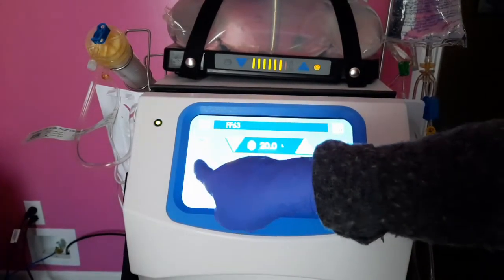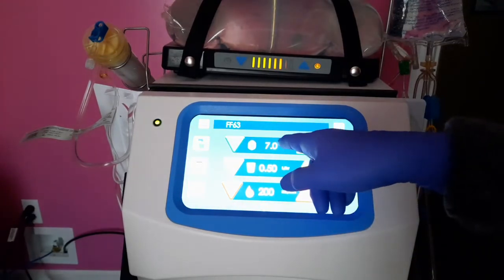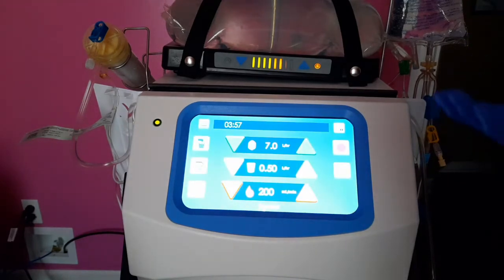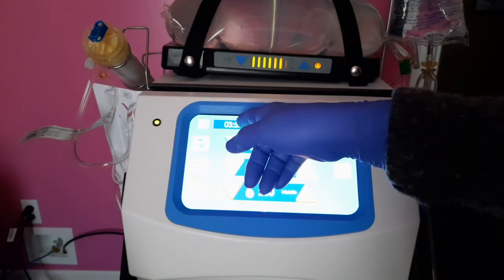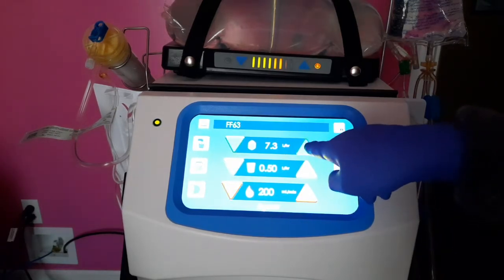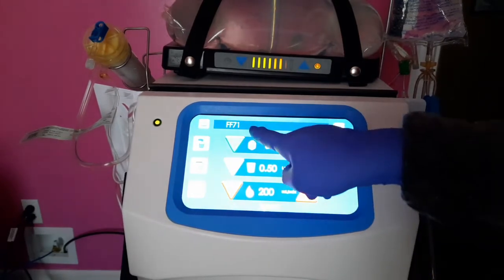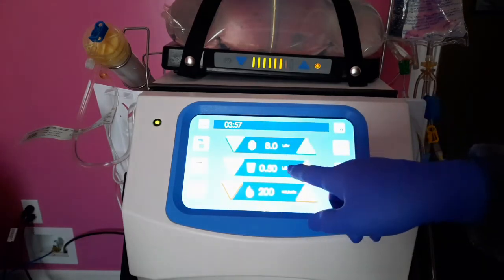So I hit that blender again, which is the toggle button. All right, this is how many liters of dialysate per hour, 7.0. Pretty much you divide how many hours into the number of liters. So I usually do 3 hours, now I do about 2.5. So I'm going to make this an 8. That'll bring my time down. Well, it didn't, because I have to put this in.